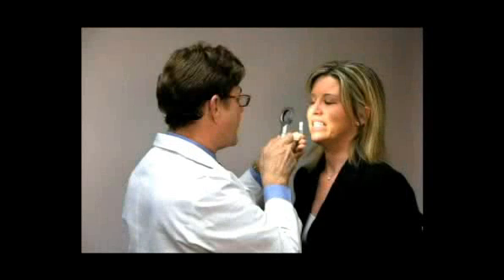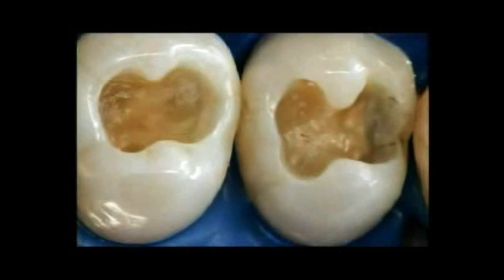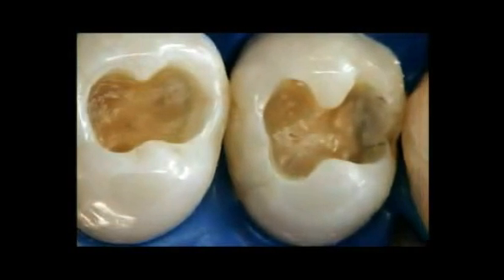After shade determination and dental dam isolation, the carious dentin was removed with a number 6 slow-speed round bur. The carious dentin lesion is identified and characterized by having 2 distinct layers. The outer layer, infected dentin, is heavily infected by microorganisms.